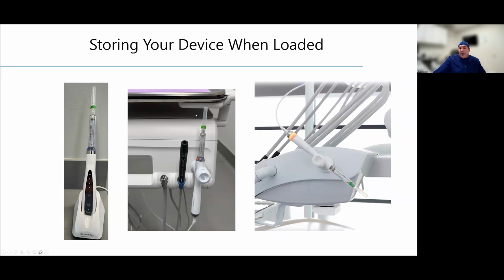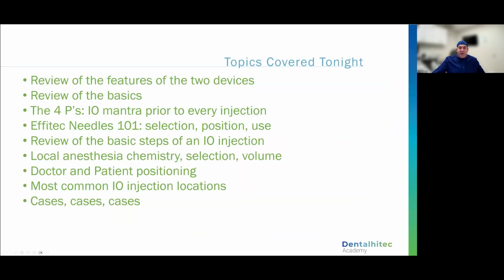Same thing with your Sleeper One. I happen to have mine mounted on my ADEC unit here, and it's okay at rest, when it does not have a cartridge loaded, to have it in the upward position, but don't do this. It's designed so that it can be flipped down or on an angle once you have that cartridge loaded. All right.